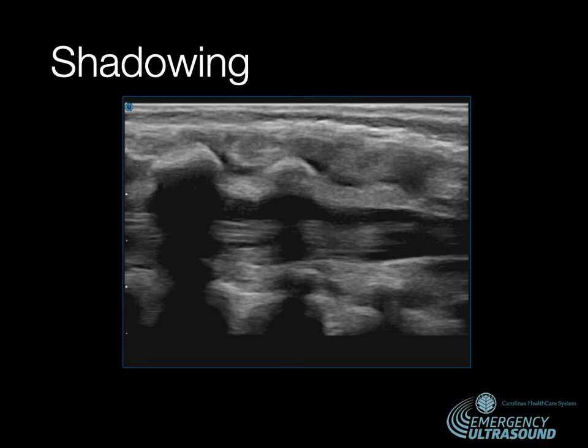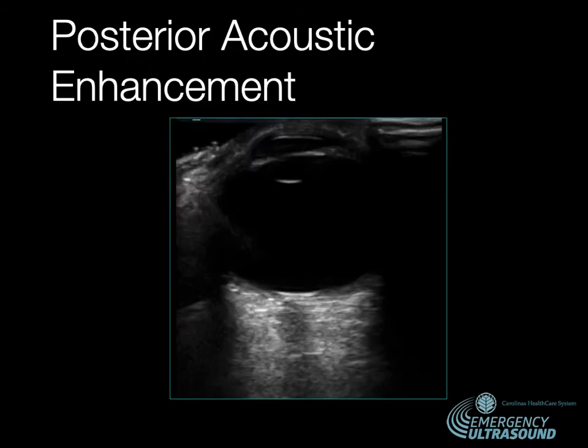One of the other ultrasound artifacts that we see is shadowing. Shadowing is a signal void, an empty black space behind a highly reflective object such as bone or stone. This can also occur at areas of acoustic mismatch such as soft tissue and gas. If we look right here, we're looking at the ribs, and we'll see rib bone and then see shadowing just beneath that.